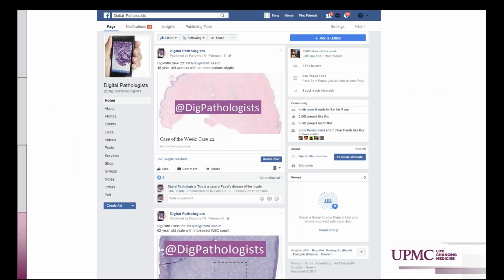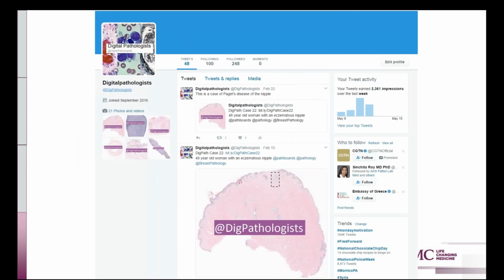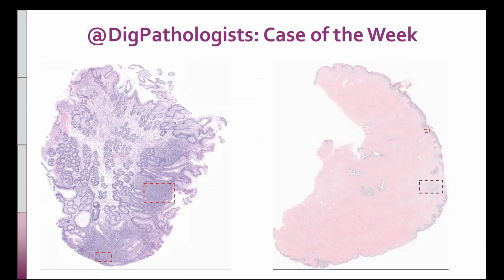So this is a screenshot from the Digital Pathologist Facebook page, where we currently have over 2,500 followers. And this is a screenshot from the Digital Pathologist Twitter page, which was created at the initiation of this project, and in just a short time has accrued over 240 followers. These screenshots represent 2 of the cases that were posted. The red boxes indicated Z-stacks, and the black represent the higher magnification scans. So you can see the flexibility of the system in terms of scanning regions of interest at higher magnification and for regional Z-stacking.